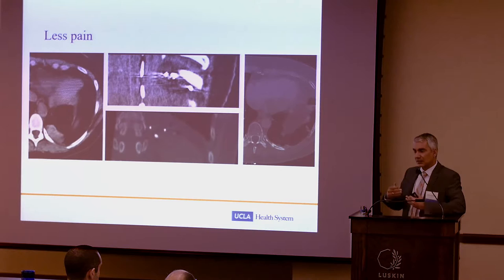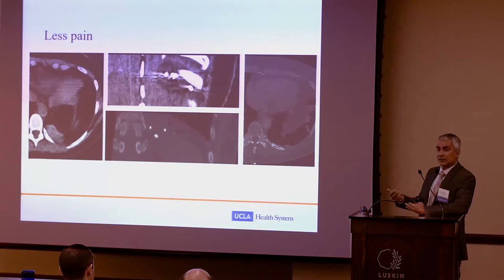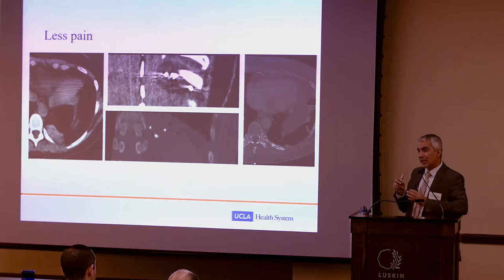Here's the ice ball kind of going, and this is a spinous process. This is back here. You can see some of the ice ball, not here. You can see it develop here. And this is the same patient 6 months down the line. You can see how the tumor, the cells rupture and sort of melt away. One of the things you see is not only the cells melted away, but the cells within the rib also melted away. But the structure of the rib remains as it is because its matrix remains intact.